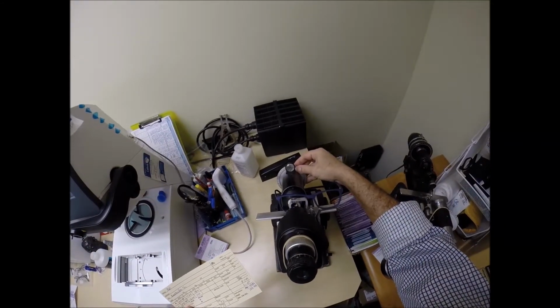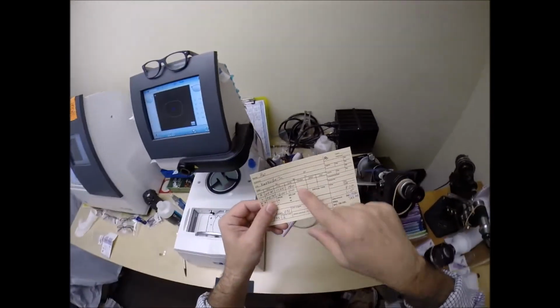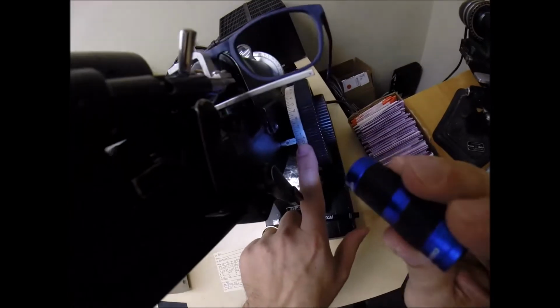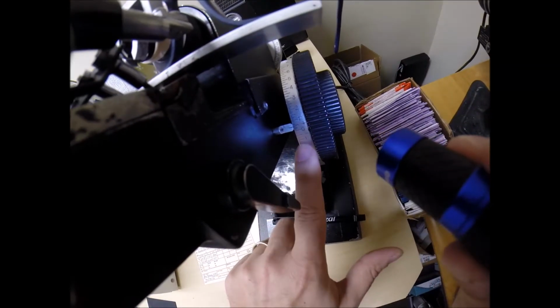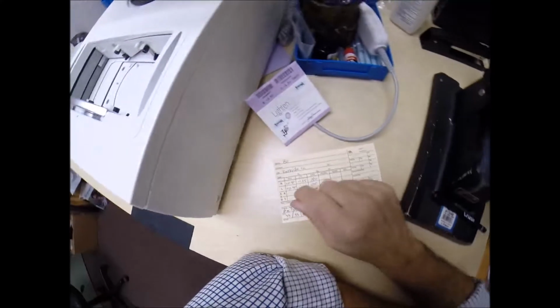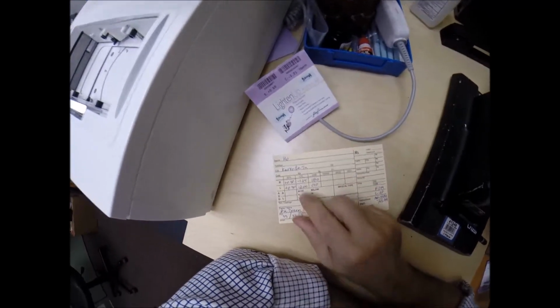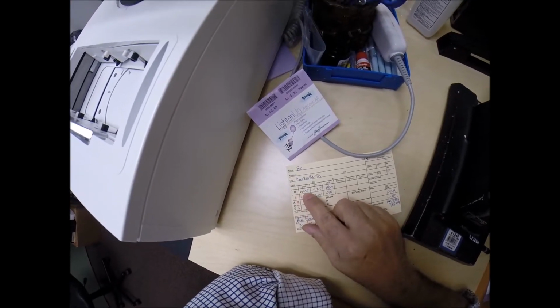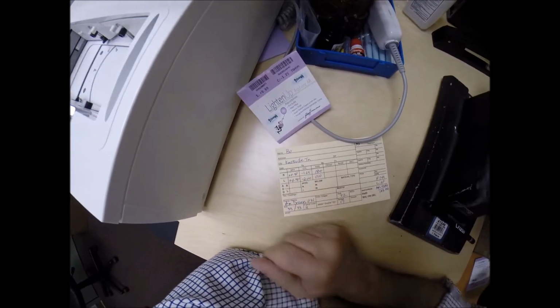With your prescription, we need to turn the axis wheel to 0, which is also 180. We're going to read the power, and I'm getting plus .50. We're exactly halfway between 0 and 1. Now you are farsighted with your glasses off. Everything is much too small. That is why there is a plus sign. Your lens is magnified 2 steps. You're on the 2nd rung of the ladder.